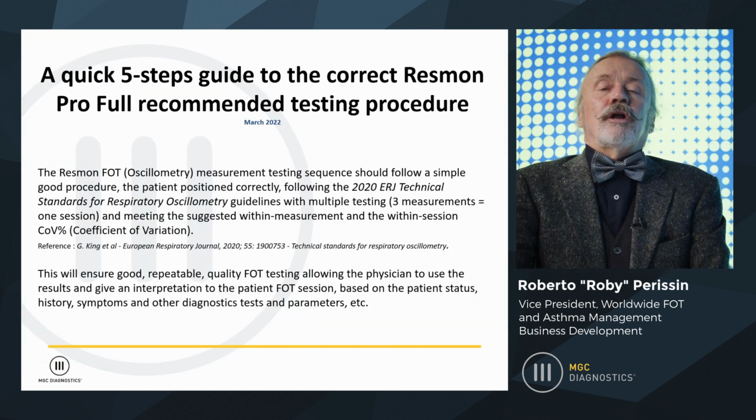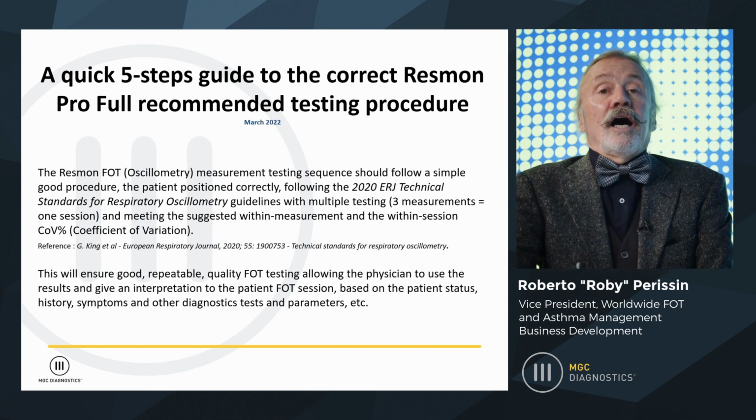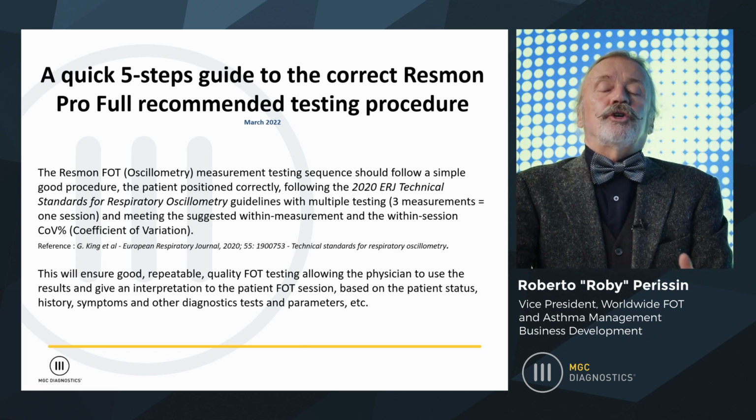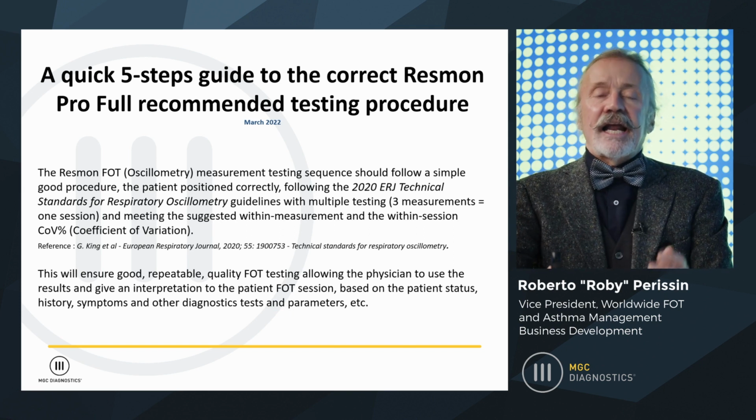Part of our educational material that we have developed is a quick 5 steps guide, according to the guidelines, to perform the recommended testing procedure, so that the physician or whoever interprets it has a very nice, good test.